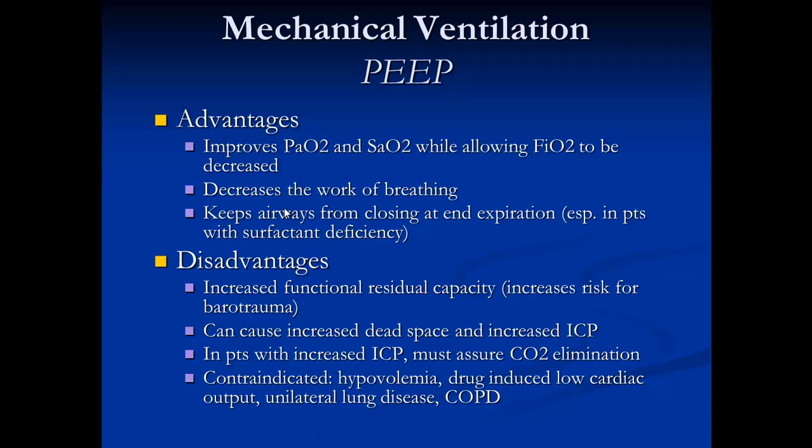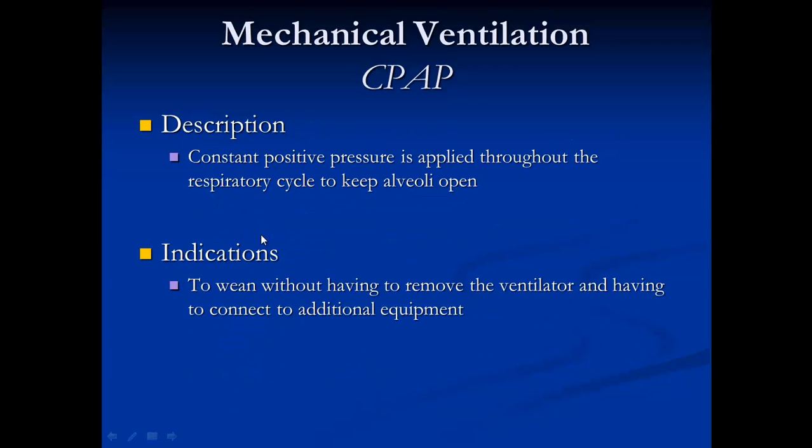If the patient is severely sick and requires PEEP of 12, PEEP of 15, you have to be able to achieve proper oxygenation status. But the risk for barotrauma increases the higher you go.